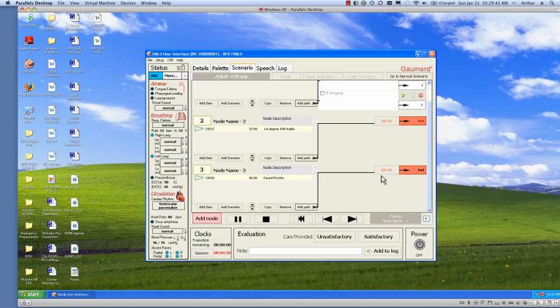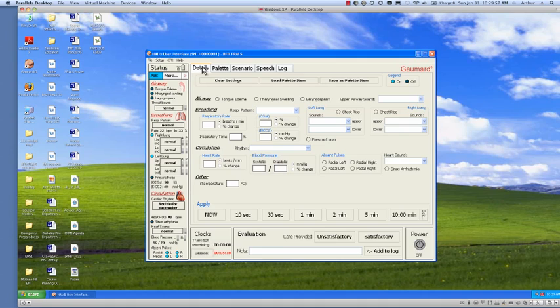This will continue to play for 9 minutes and then it will stop. Or I'm sorry, 10 minutes and then it will stop. It's counting down. So there's enough time in here for you to run through the rest of the scenario, and there won't be any changes with that. If you wanted to increase the blood pressure, all you have to do is come back over to the details area, click in, and say they're giving some fluids, and that's really great.